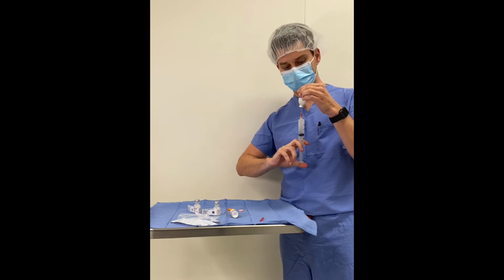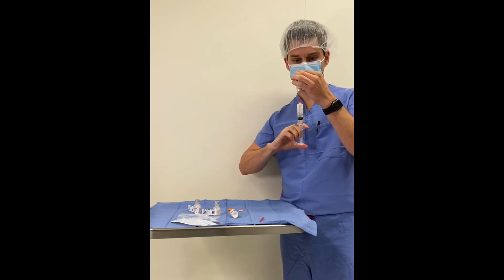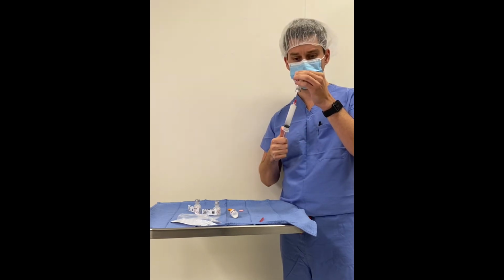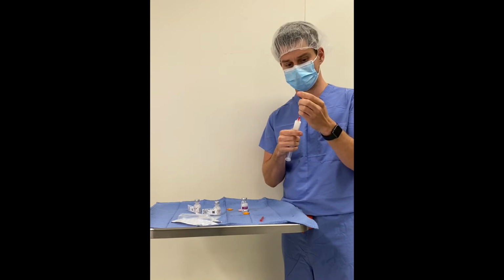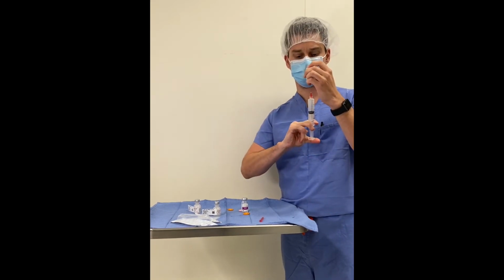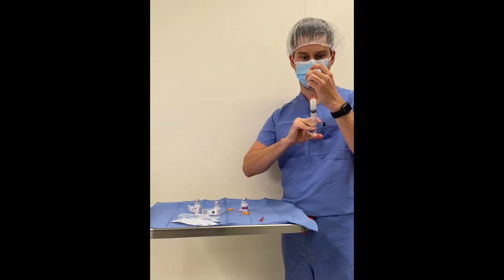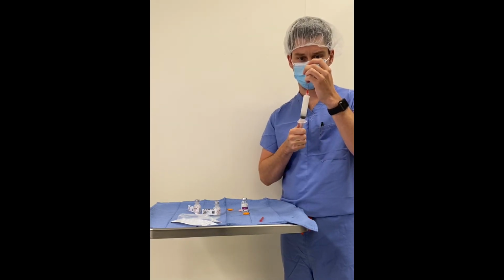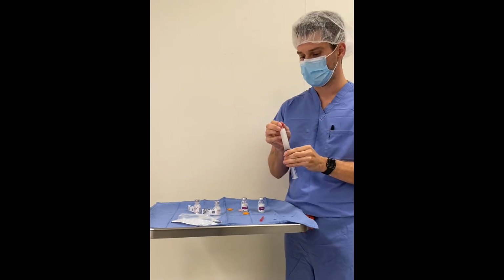In this example, we are reconstituting a medication, so you can see the resident injecting the saline he drew up into the Ancef bottle and mixing thoroughly. He'll do this twice to achieve the desired dose of the antibiotic. When the medication is drawn up, be sure to recap the syringe to avoid any inadvertent needle sticks.